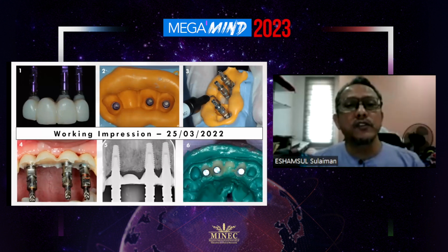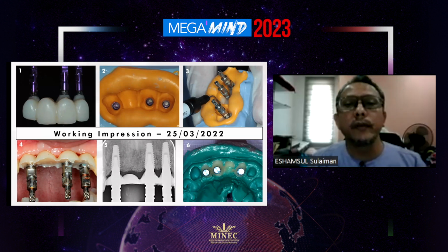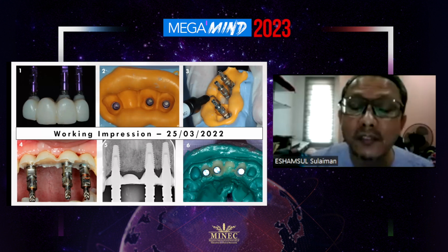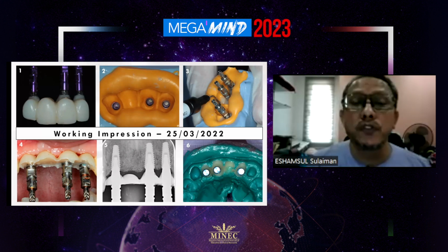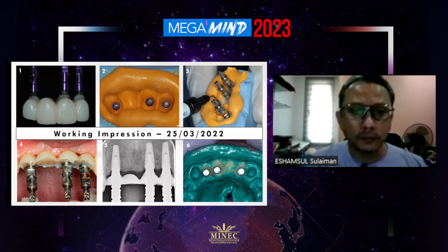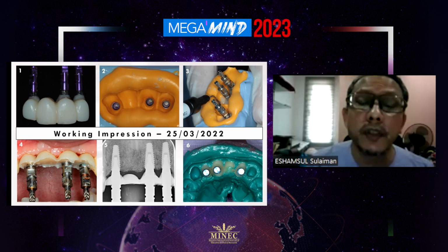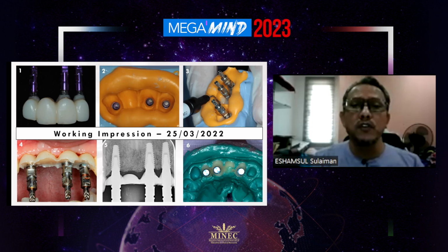Prior to the impression taking, I actually copied the emergence profile around the implant as well as the pontic using this technique. So first attach the provisional to the analogs, which are then embedded in polyvinyl siloxane putty and light body to capture the emergence profile.